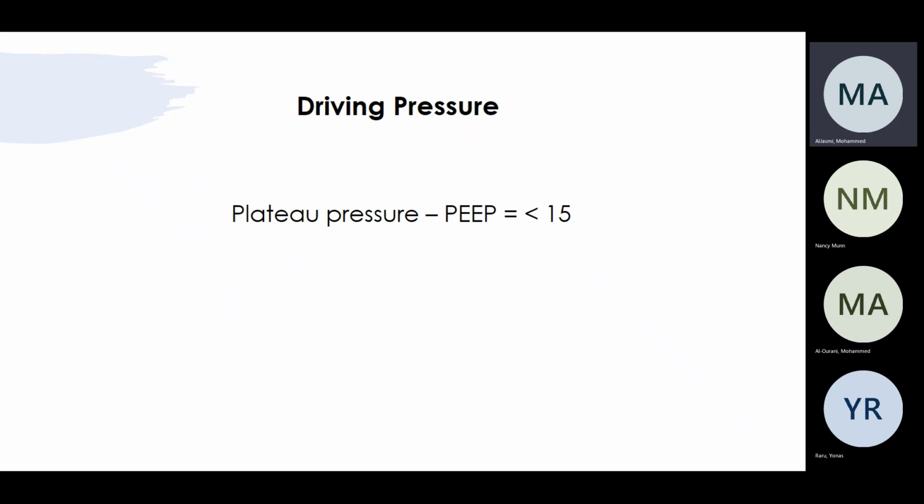Okay, I went to 12. If the lung has no compliance. Okay, so I went from 10 to 12. The peak pressure went to 30. It was 28. What would you do? So you are still not recruiting more. Why is that? Because the peak should go down when you recruit more lung. Good. More alveoli. So that's right.